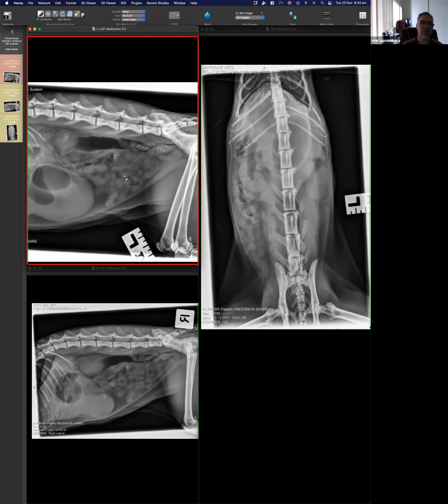And then based on that, there is also the technology where you look at something, and then before you close the exam, it's gonna tell you, you've been looking too much at this area. Do you want to rethink your report? Make sense? So it's gonna capture your pattern of how you looked at the image. And then before you close, it's gonna tell you, you look too much here, you look too much there. Do you want to reconsider? Because we know that errors are sometimes because of things that we overlook.